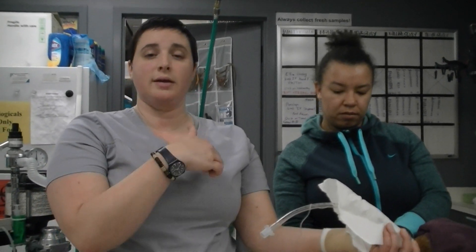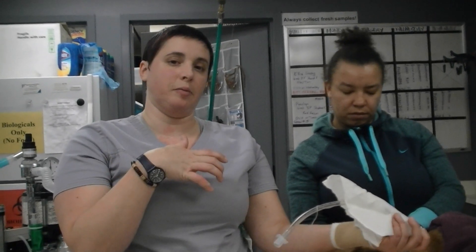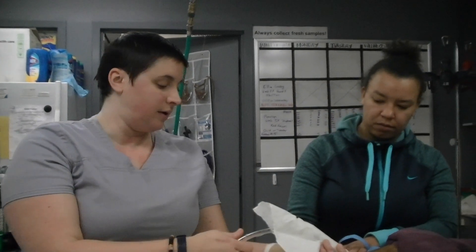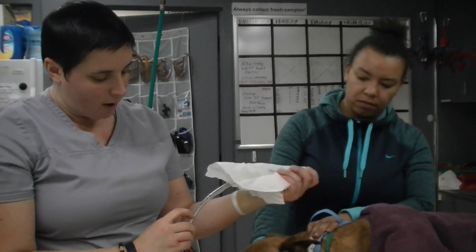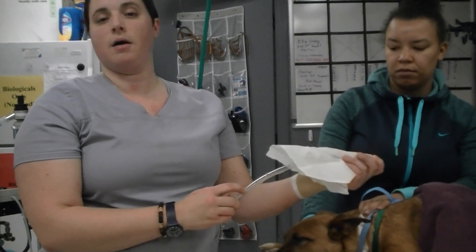The trachea splits into two bronchi going down to each side of the lungs, the left and the right. I want to make sure my tube doesn't go down one side only, or sit at that bifurcation and not oxygenate them appropriately or deliver the gas that they need. So when I place this tube, I'm going to make sure I tie it in to where her incisors touch right here at the eye on the ID.